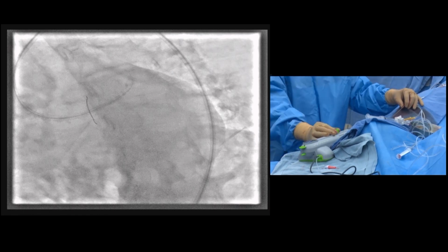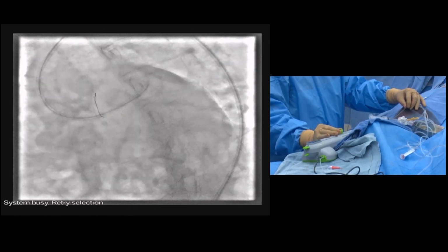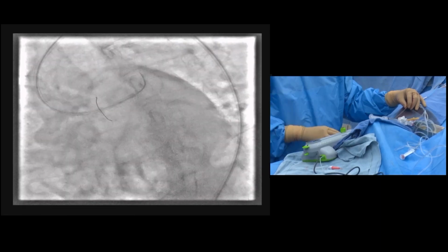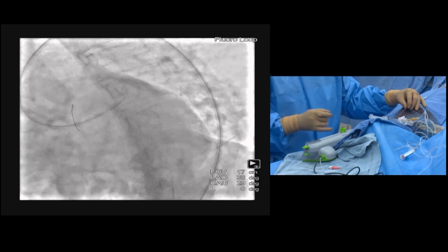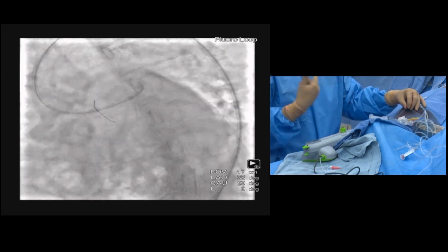I am starting with 80,000. Now I am going very, very slowly. I am doing forward cutting, 1 mm. Now you see slow movement only. You should go very well. For every 20-second cycle, there will be a beep. Once you get the beep, immediately you stop, and again a 15 to 20 second interval should be given. Then you can redo the next cycle.